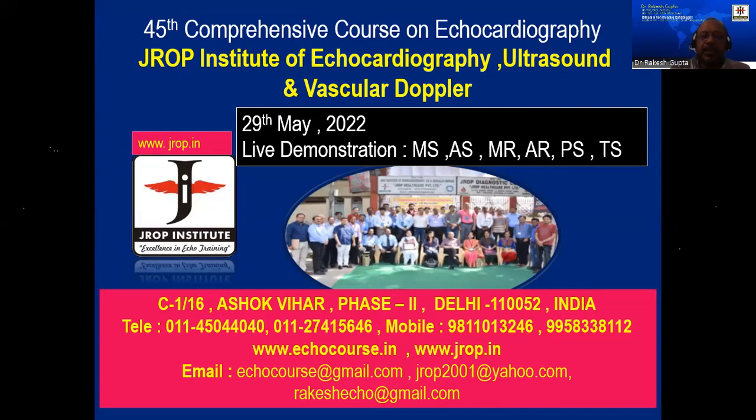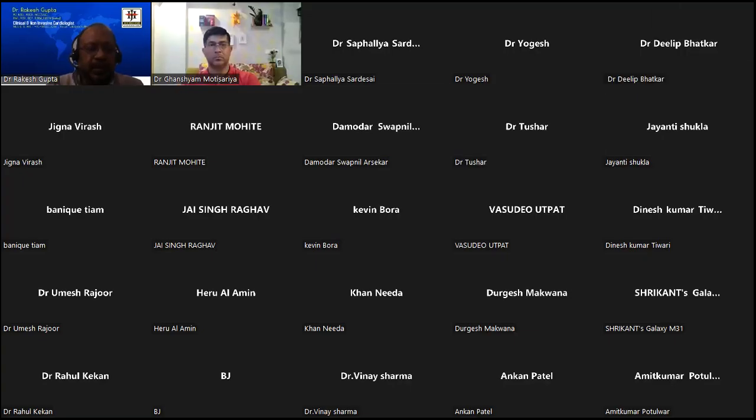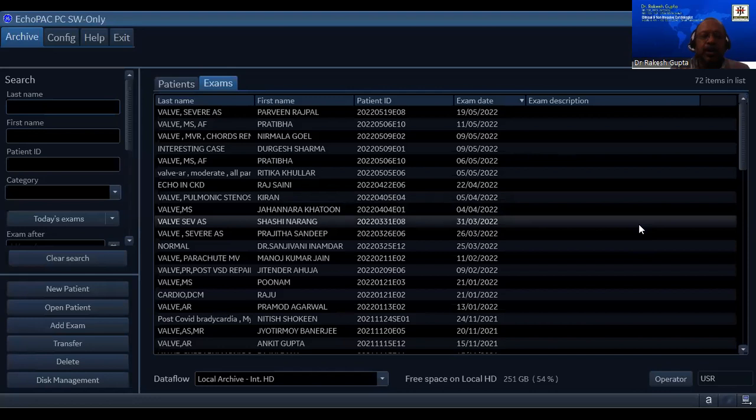I'll get going with a live demonstration, picking up cases from a machine directly. And I'll ask a few questions from the delegates themselves, like how do we really look for these features? Let me share my machine first of all. I hope all of you can see my screen. Can anyone confirm? Yes, sir. Okay, all right.